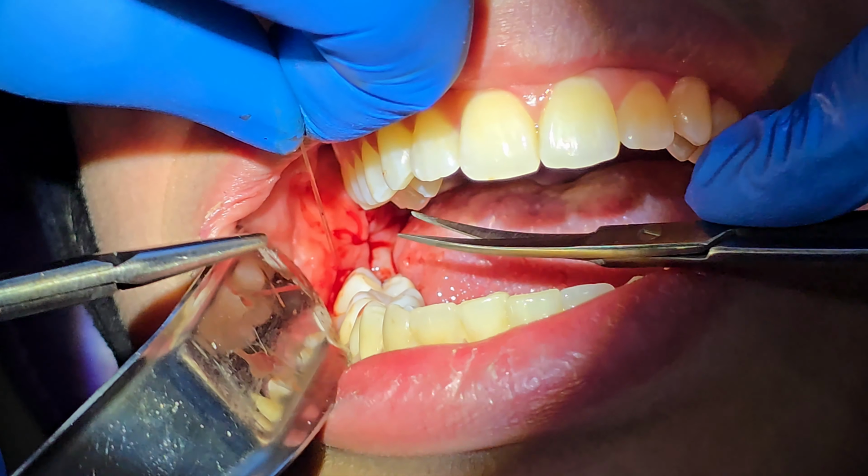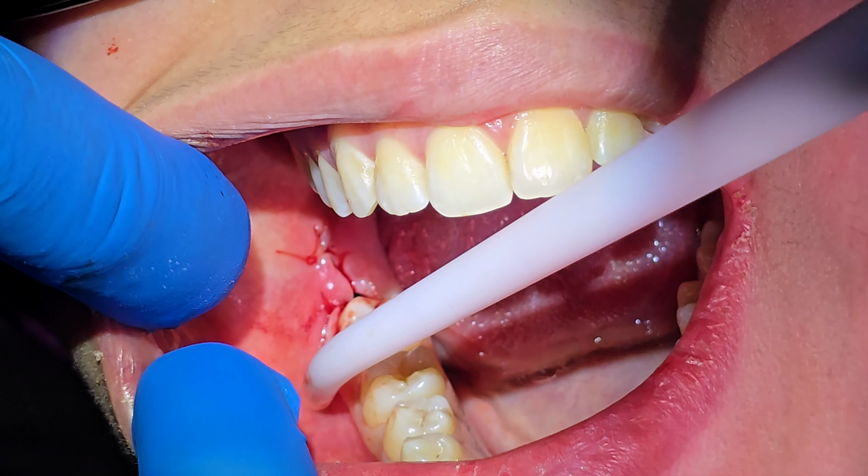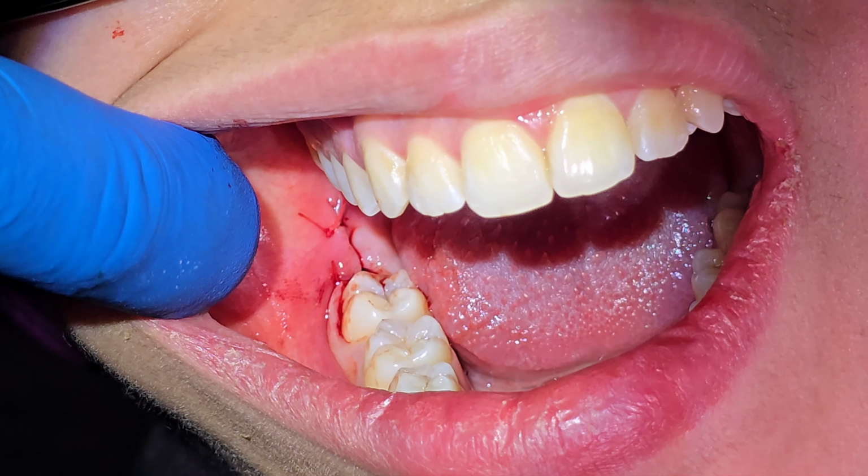and we're there. So a bit of suction there please in a moment. Good, that's fine. Excellent, very well done.